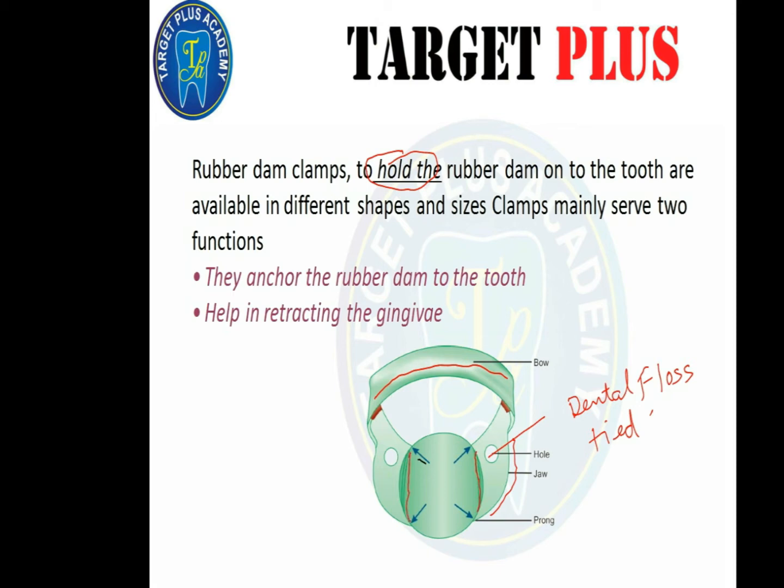So remember, these clamps should contact teeth from all the sides. Remember, a clamp should contact teeth from all the sides. Now this is important for your exams.